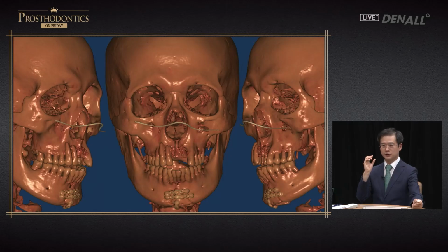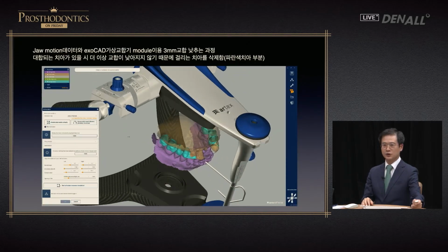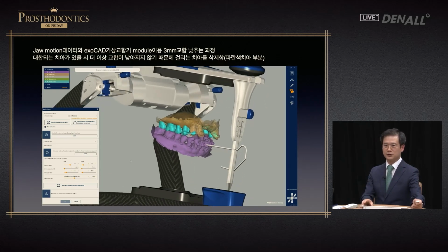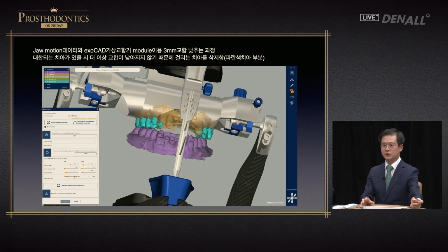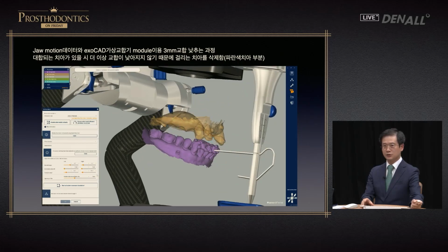In the virtual articulator, as mentioned, there's a collision mechanism. Once a certain tooth has contact, it does not progress any further; it does not go through the teeth. So in an arbitrary manner, I removed the teeth, and the articulator goes down to negative.